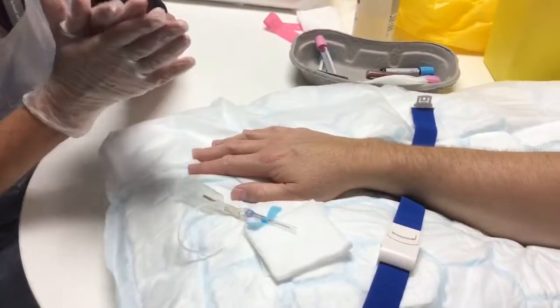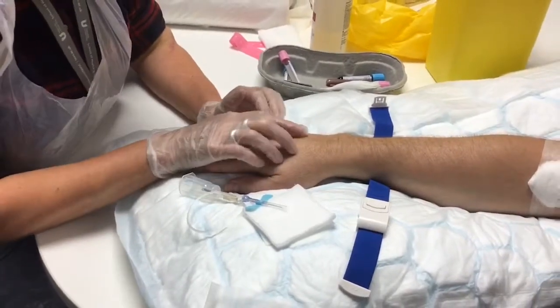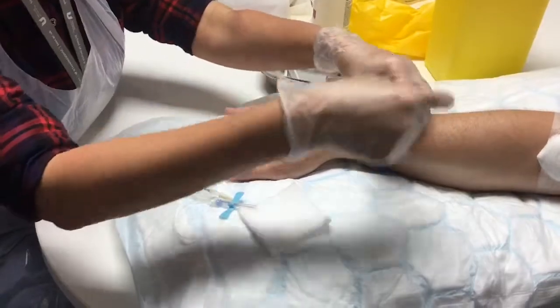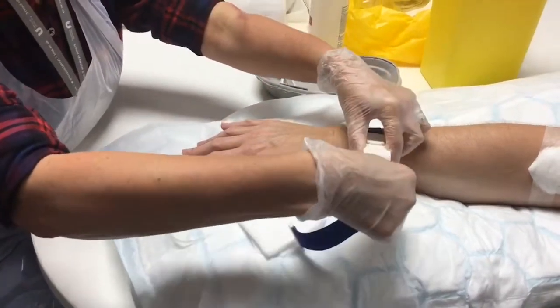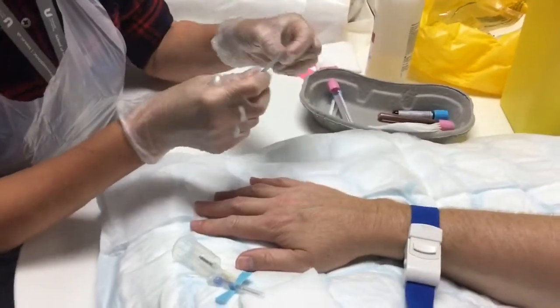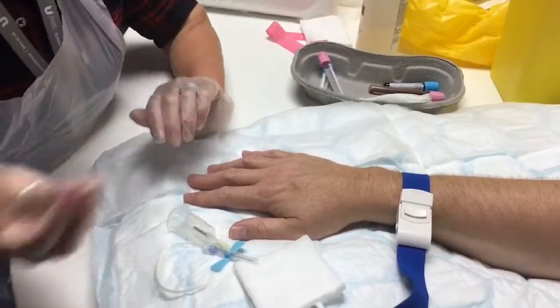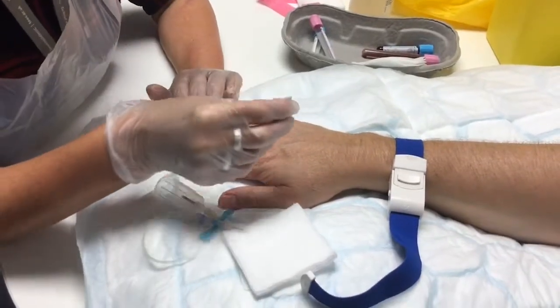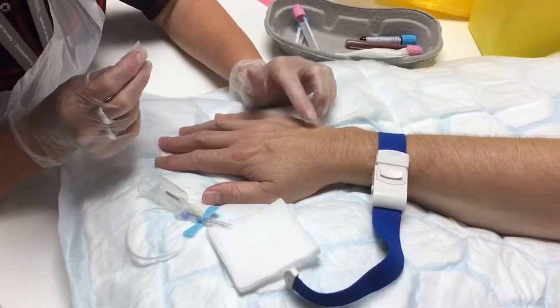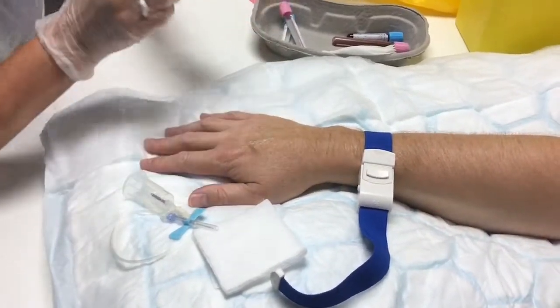I'm not going to unsheath it yet because we want to find a vein first. We've got some lovely ones in the back of the hand here — no problems at all. I'm going to pop a tourniquet on again, just lower down. Mark has already consented and knows what I'm doing and why. I'm going to clean the vein — pick a good area and give it a clean.